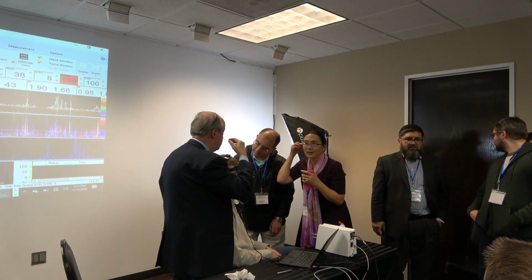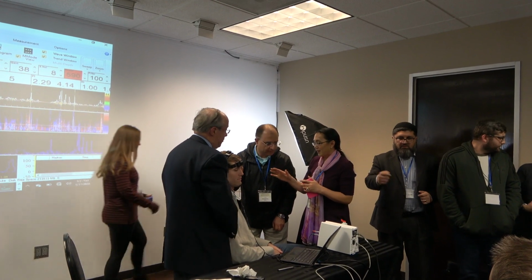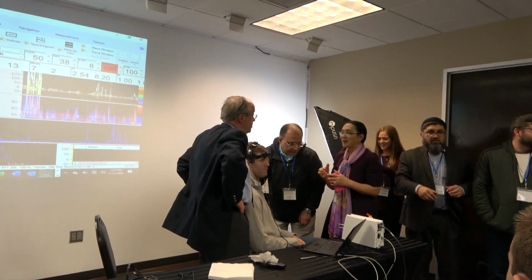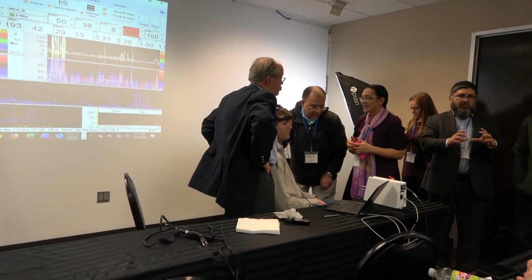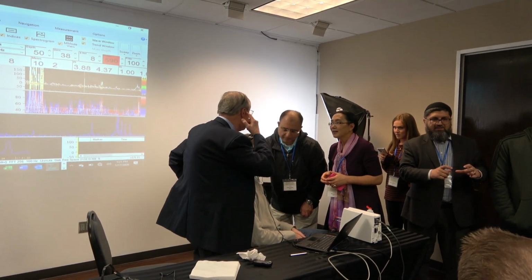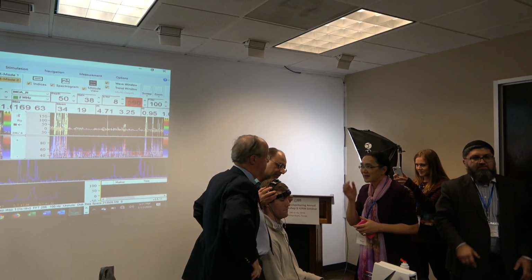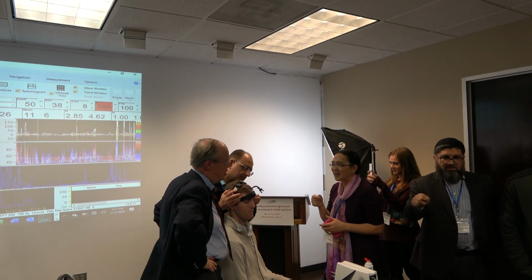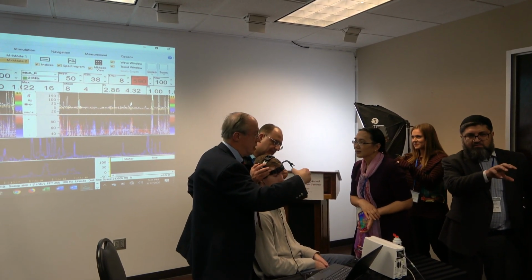It has an RF connector or S-video connector. On the Cadwell machine you can connect it, especially for TCD, so it's hard to find the signal. You can see the screen and you're taking the picture, like a time lock. Actually it's time lock. If you change the time frame you can drag it and you see the camera.